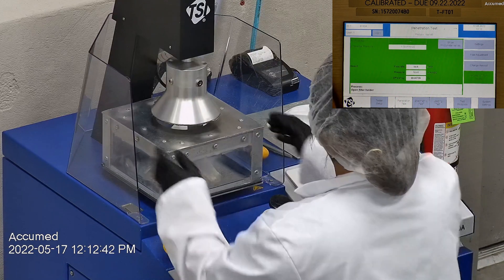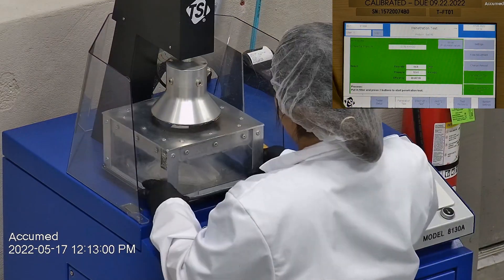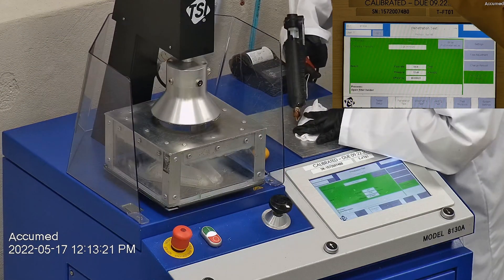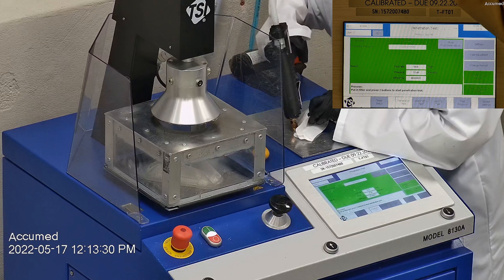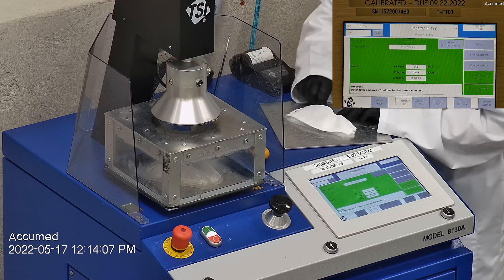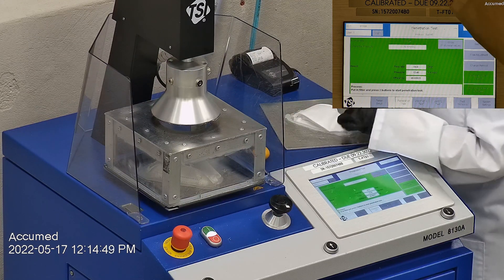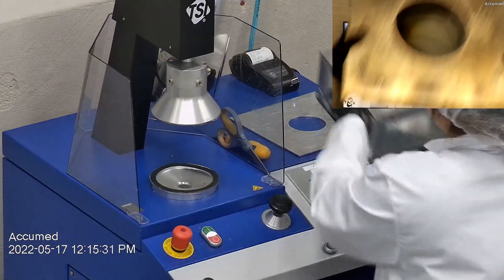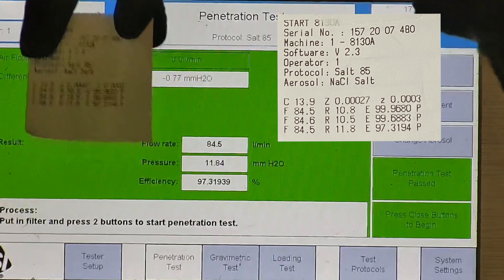The first sample tested at 99.96% filtration efficiency with a pressure drop of 10.8. The second sample had a filtration percentage of 99.68% and a pressure drop of 10.5. The last sample's filtration percentage was 97.32% with a pressure drop of 10.5.